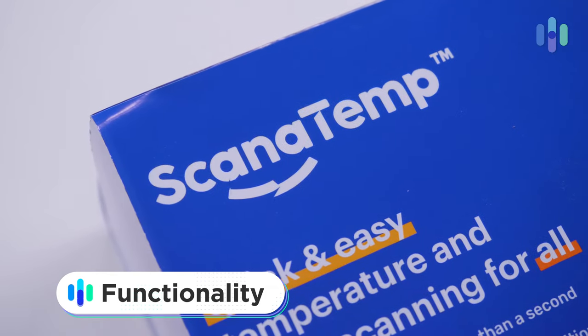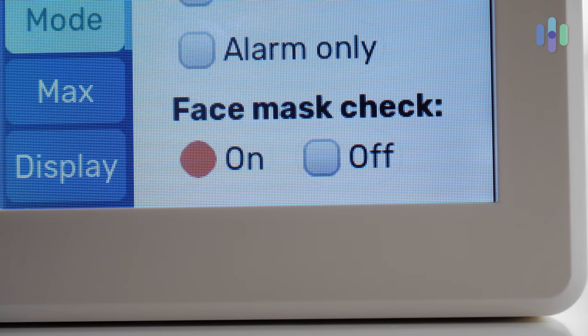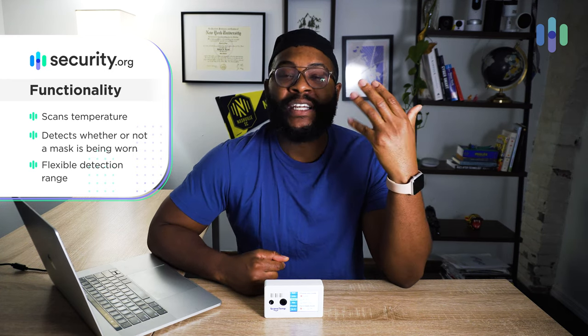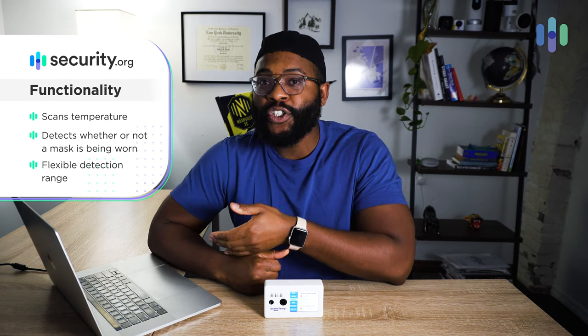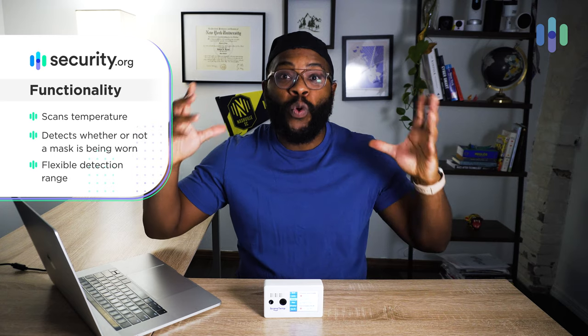Scan-a-Temp has two core functions. One is temperature scanning — that's probably the primary function. The other is mask detection, and that's the only one that can actually be turned off. What's interesting is that it works from just about any height. I'm 6'1" and could stand any number of feet away from it, and it can pretty much always determine my temperature and whether I'm wearing a mask. My brother, who's 6'3", same thing. His wife, who is about 5'3", also stood in the same locations and it determined her temperature and mask status too.